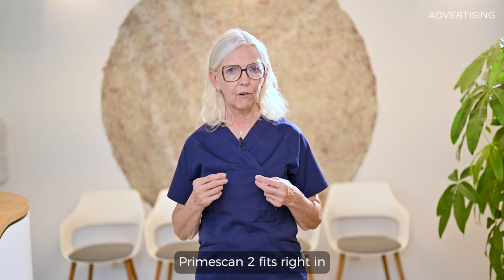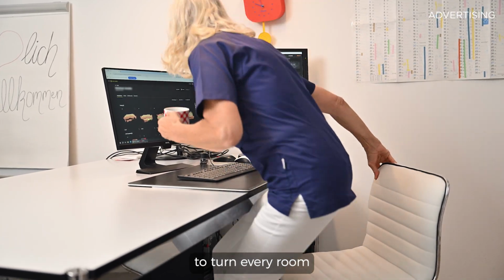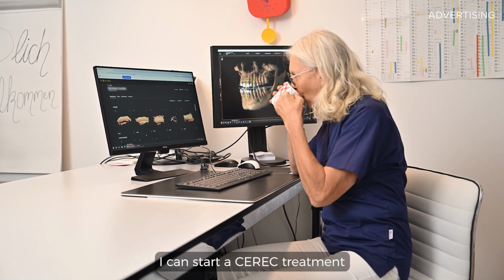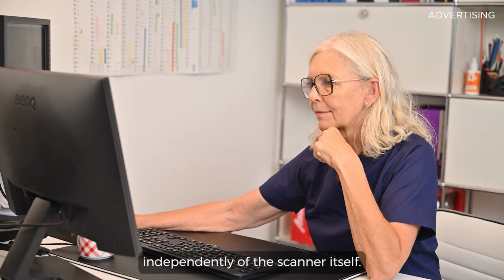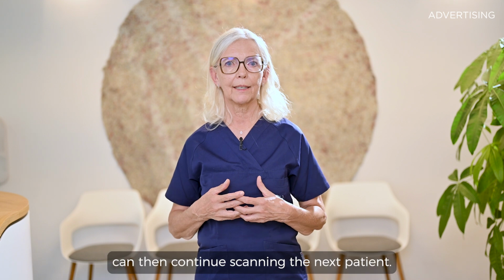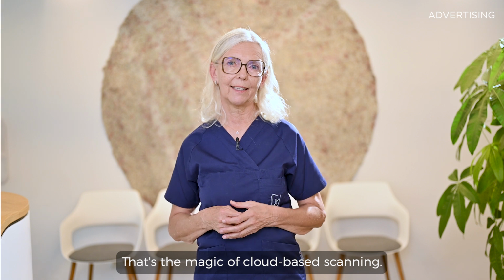Primescan 2 fits right in with the classic chairside CEREC workflow. It gives me the possibility to turn every room in my practice into a CEREC room. I can start a CEREC treatment from every room and continue working on the design independently of the scanner itself. And my team can then continue scanning the next patient. That's the magic of cloud-based scanning.